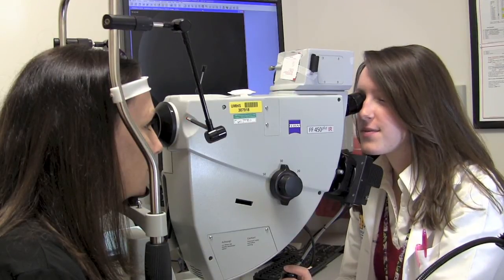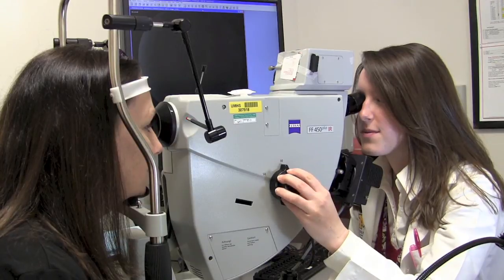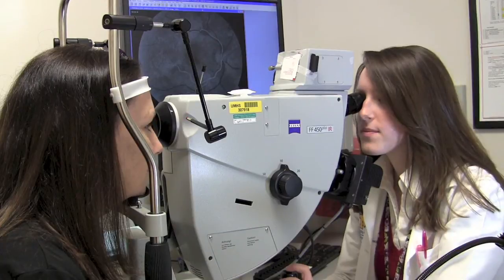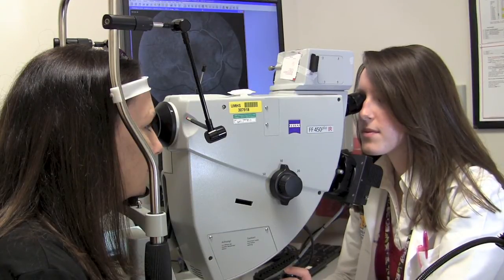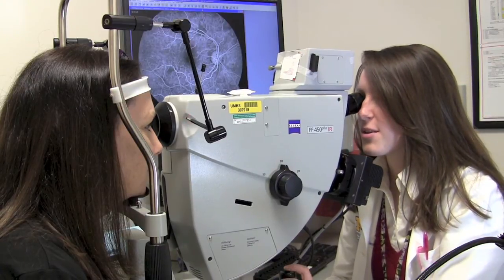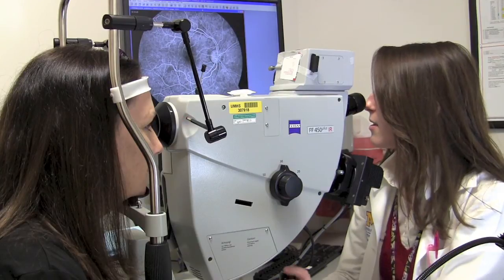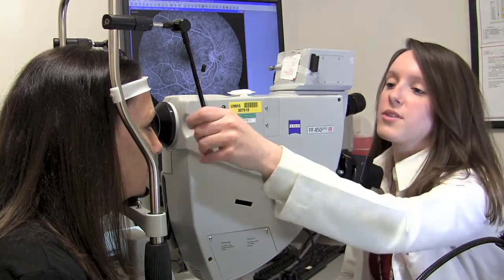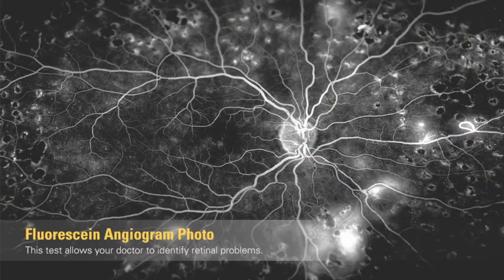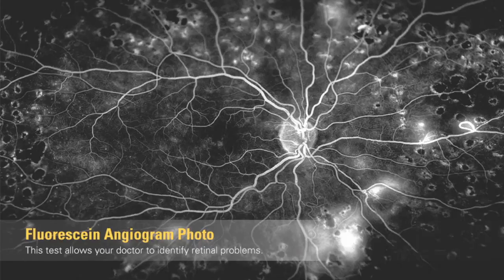A third diagnostic test is the fluorescein angiogram, used to evaluate the blood vessels of the retina, choroid, optic nerve, and iris. First, we take fundus photographs of the eye, and then we inject a dye called sodium fluorescein into a vein in your arm. We then take pictures of the dye as it moves through the blood vessels in the retina and choroid, the two layers in the back of the eye. Fluorescein angiography can help diagnose diabetic retinopathy, vein occlusions, artery occlusions, edema, and tumors.